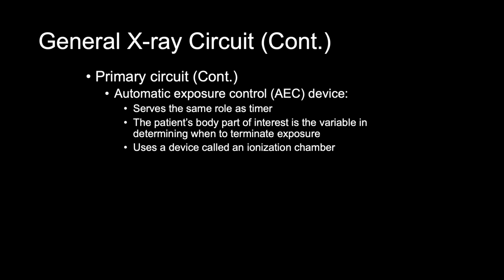They do this by exposing phantoms until the desired density or the image quality factor is achieved. This amount of exposure varies with the IR, and the AEC must be recalibrated if we have a receptor change. For example, going from one film screen speed to another, or from film screen to a cassette-based digital system.